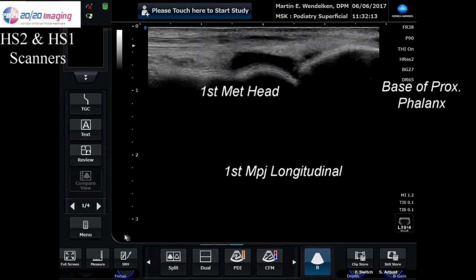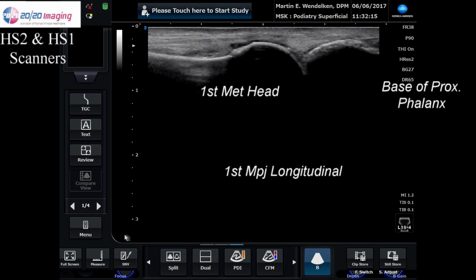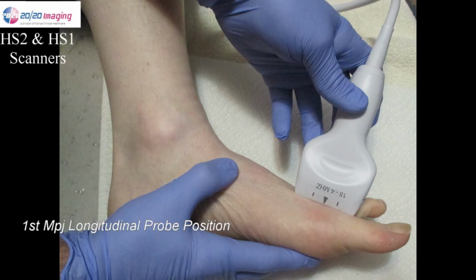Let's direct attention to the dorsal aspect of the foot at the first MPJ. This is the position of the probe in the long axis.